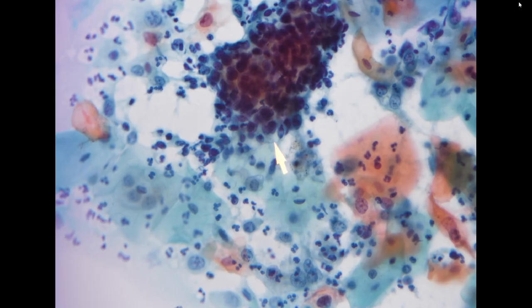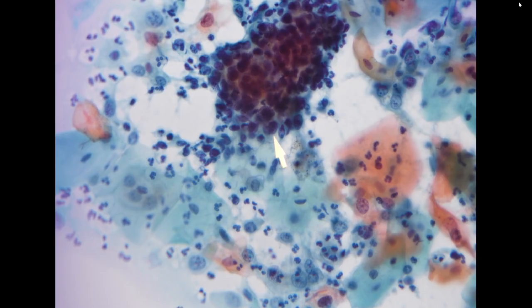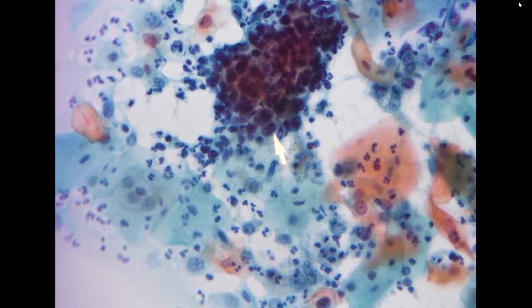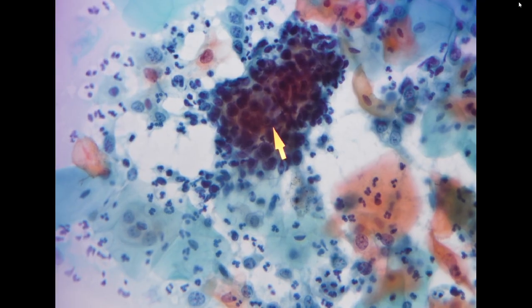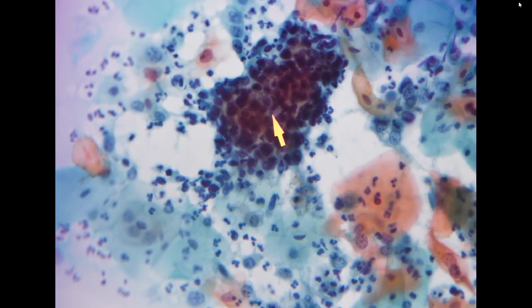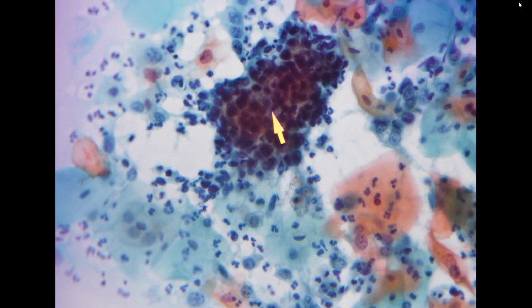So we would call this a hyperchromatic crowded group, right? For the hyperchromatic crowded group, the differential diagnosis has a very wide range. It can be a glandular lesion, it can be a squamous lesion, it can be reactive, it can be neoplastic. So we have a broad differential diagnosis.